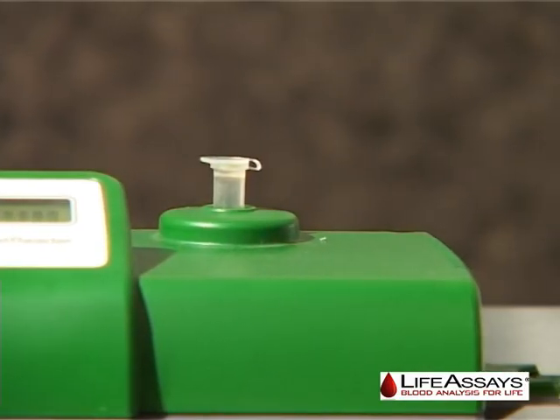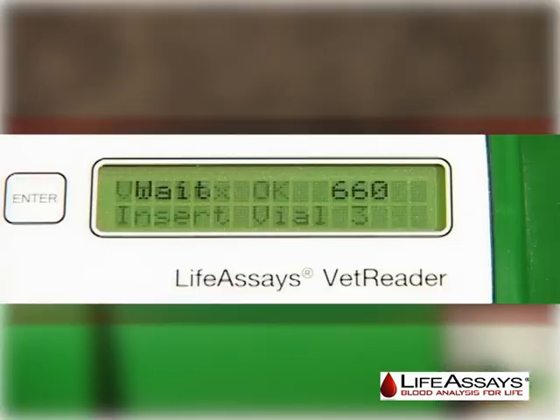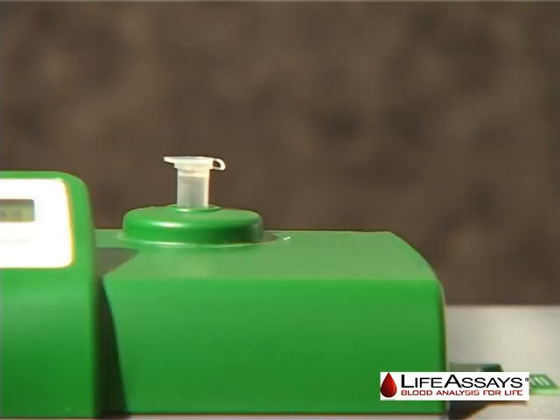Once the reagent vial has been loaded back into the instrument, the display will show weight 660 and the instrument will count down from 660 seconds, or 11 minutes. At this time, the user is free to leave the instrument.